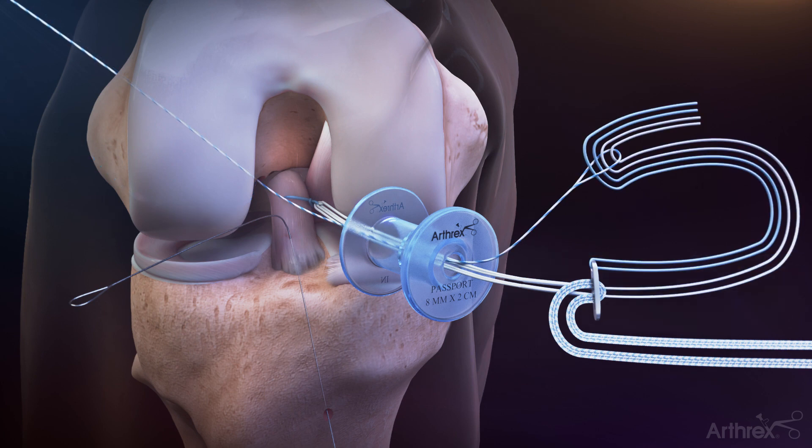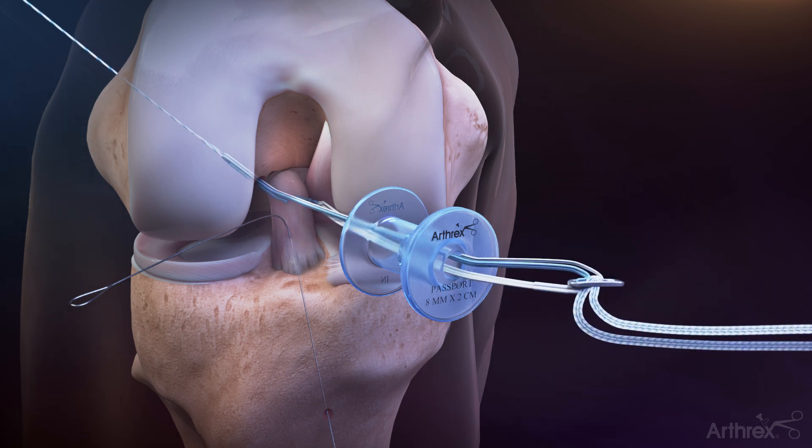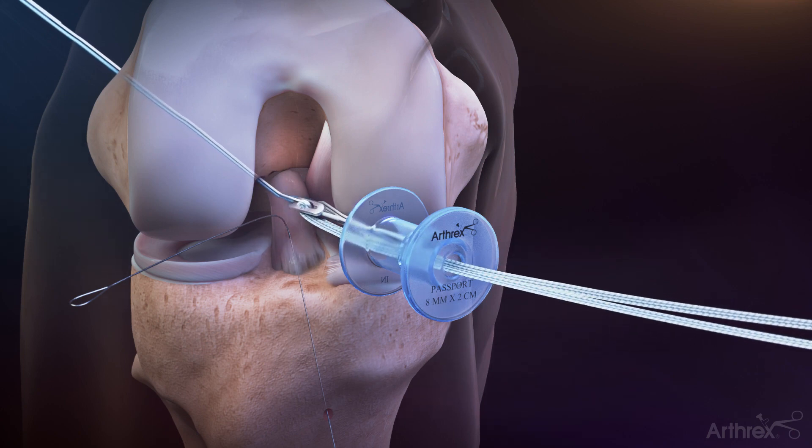Retrieve the fiberlink suture tape through the passport cannula. Identify the white tightrope tensioning sutures and the blue tightrope passing suture and load all four ends into the loop of the fiberlink suture tape. Do not load the fiber tape into the loop. Using the fiberlink suture tape, shuttle the ACL repair tightrope through the joint and out the femur.